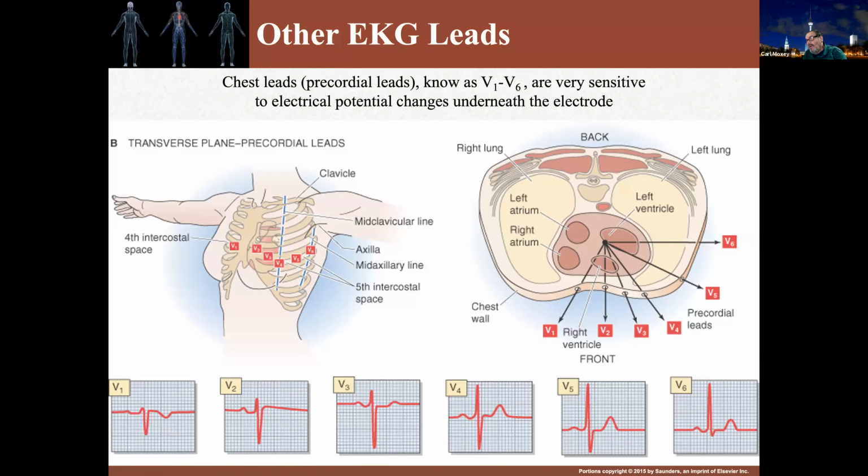Now, by the way, how do you know the fourth intercostal space? And the answer to that is, remember, you cannot palpate rib 1, but you do know where the sternal angle is, which is the junction between the manubrium and the body of the sternum, located here, and that is where the second costal cartilage attaches. So that's your second rib, and the space below the second rib is the second intercostal space, third intercostal space, fourth intercostal space.